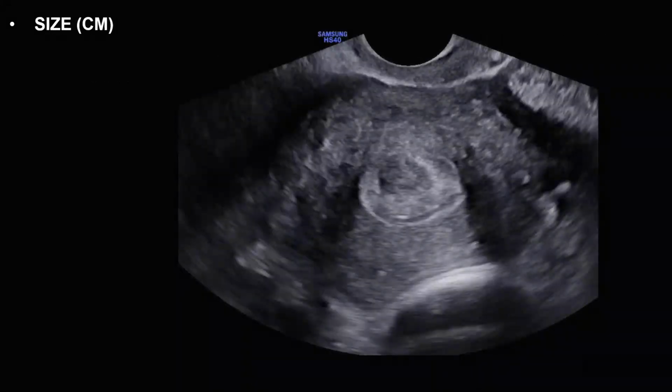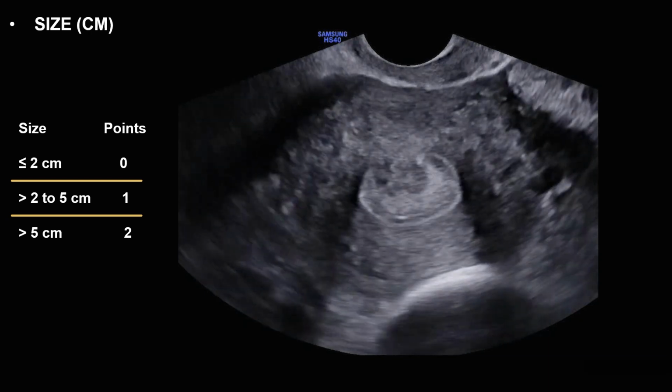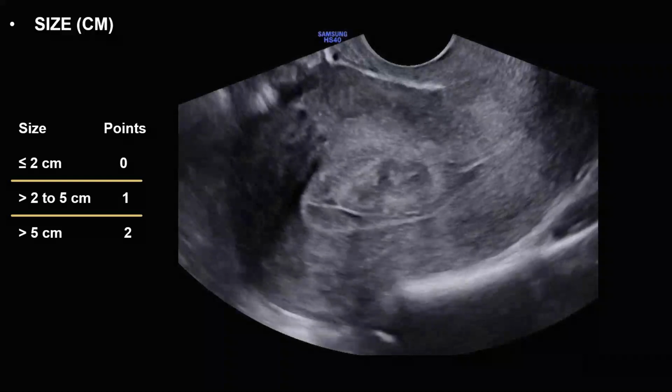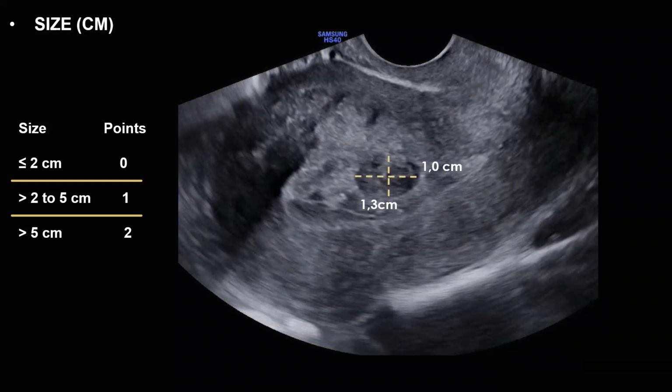As for the size of the fibroid, the largest diameters found on any axis are considered. When the nodule measures up to 2 centimeters, it receives a score of 0 points. If it is between 2 and 5 centimeters, a score of 1 point, and if it measures more than 5 centimeters, a score of 2 points. In the following exam, a submucosal fibroid with its largest diameters being smaller than 2 centimeters is observed. In this case, it receives a score of 0 points.